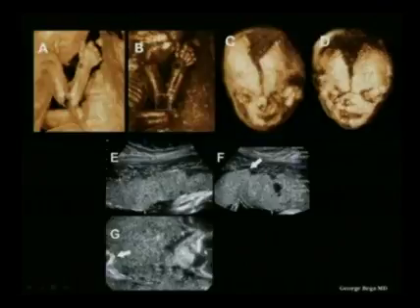Here is a placenta that was acquired, and during the acquisition, around 5 to 6 seconds, the mother breathed. She had a deep breath, and as you can see here, we have motion artifacts. Again, keep in mind that they may not be present in the acquisition plane, and the operator has to look for them in the additional planes, typically in the coronal or the transverse planes.